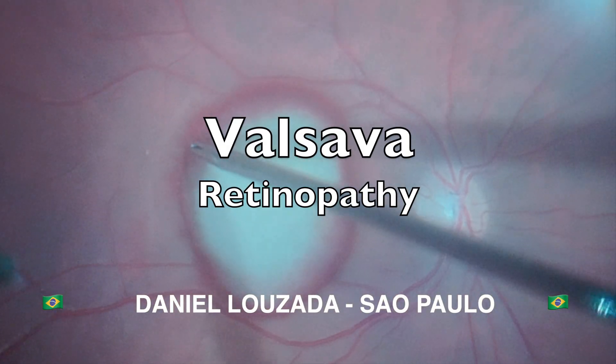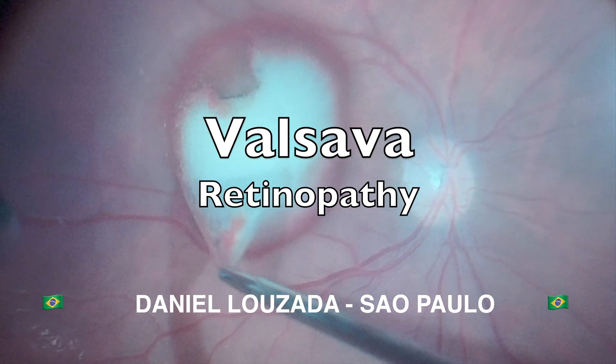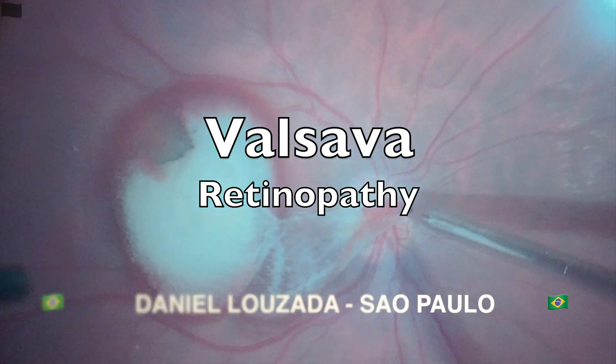In this video, shared by Dr. Daniel Lozada from Sao Paulo, Brazil, we will discuss the surgical technique for sub-ILM hemorrhage due to Valsalva retinopathy.